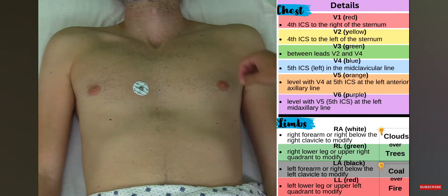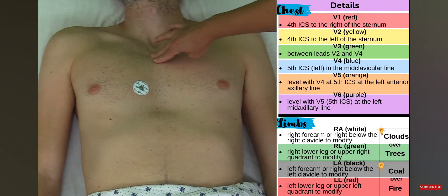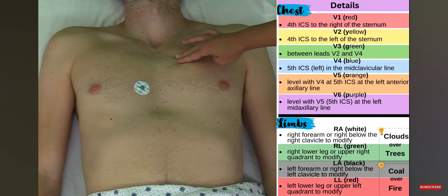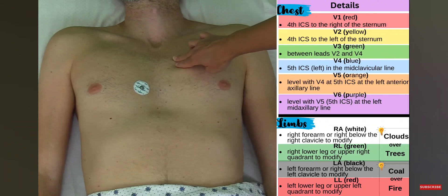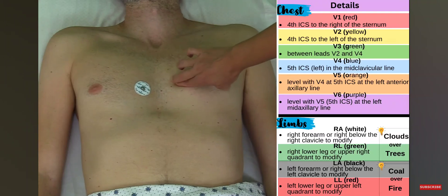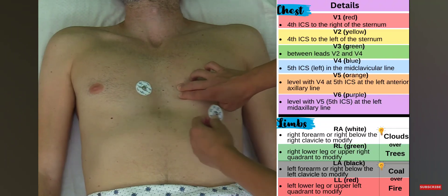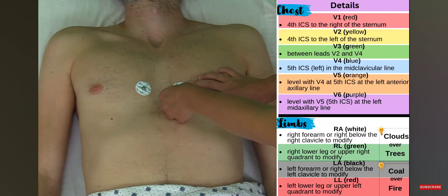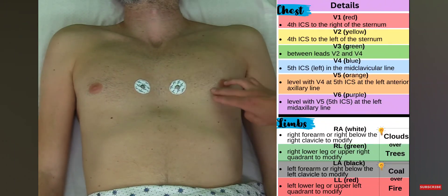Next is V2. I follow the same procedure: find my notch, go down to my angle of Lewis, then go over to the left — that's my second rib. Sliding down, I pass the second intercostal space, then the third intercostal space, then arrive at the fourth intercostal space. I'm left of the sternum, and it should be level with V1 — so I'll place it right here.